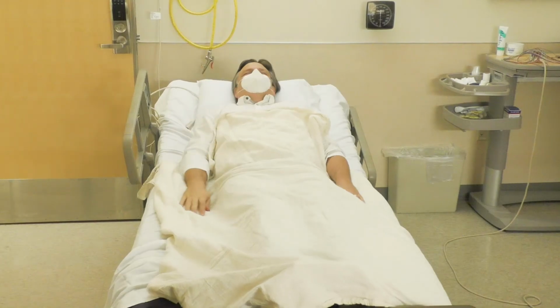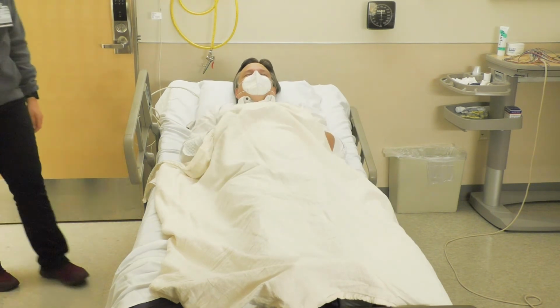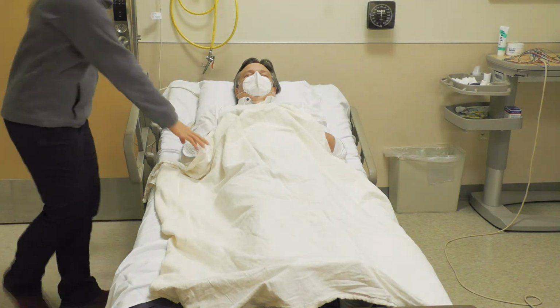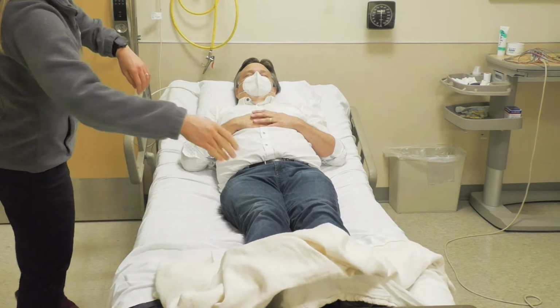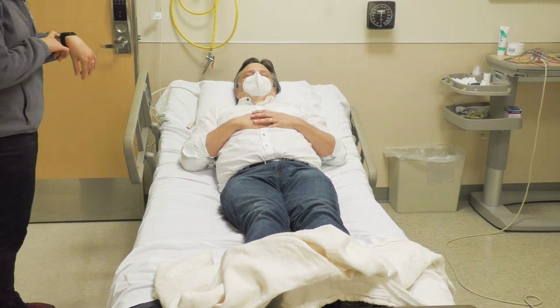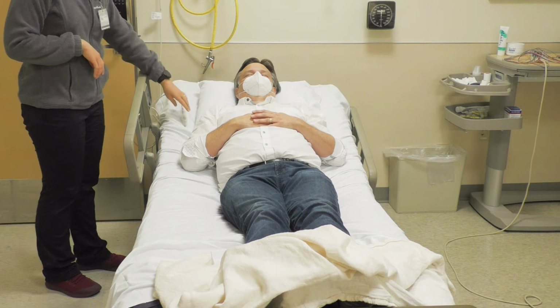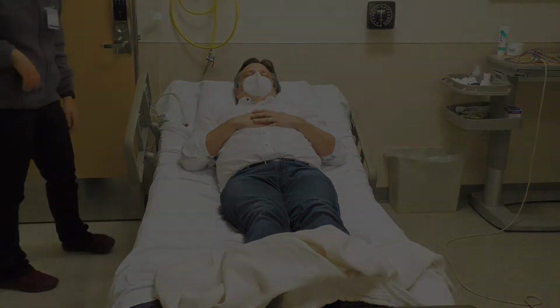In the event of a seizure, go into the room, stay out of the camera, turn the lights on and pull back the blankets. Note the time of onset and say this out loud and push the seizure button. Start time. Do your ABCs and BLS if needed.